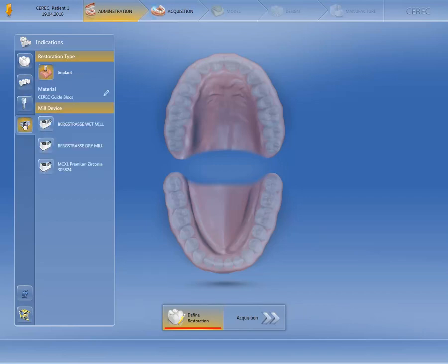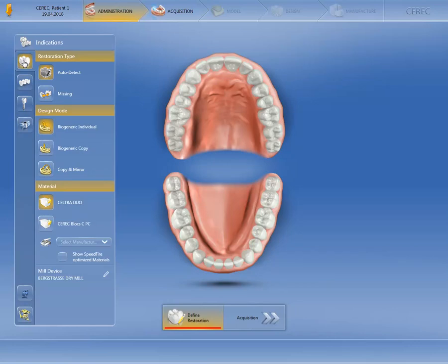We go back to our single tooth restoration and take a look at the details that should be defined in such a case. The auto-detect option is set by default. This means that after acquisition of the image catalogs, the CEREC software automatically detects whether the restoration is a crown, veneer, partial crown, or inlay.